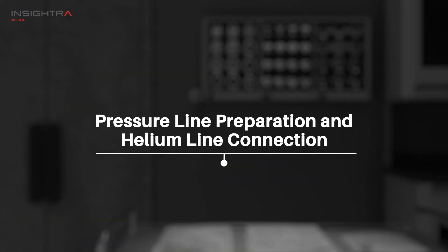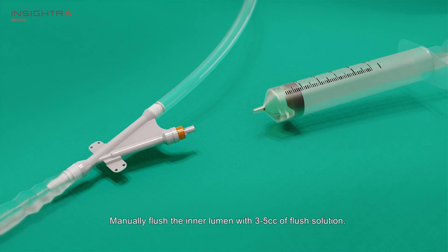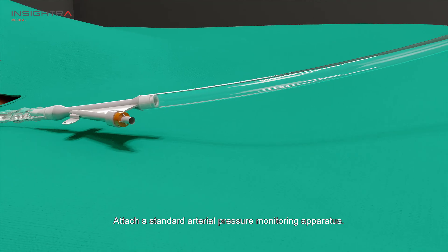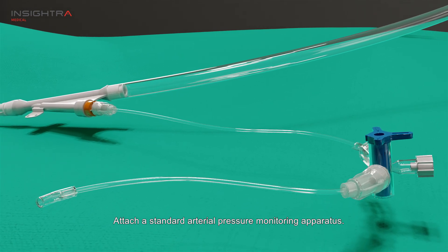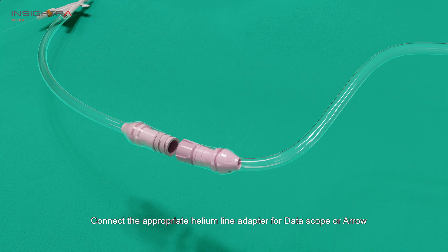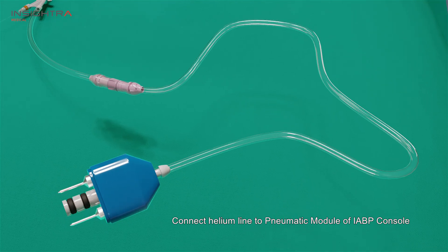Preparing the pressure line and connecting to the console. Remove the guide wire and aspirate three cc of blood from the inner lumen. Manually flush the inner lumen with three to five cc of flush solution. Attach a standard arterial pressure monitoring apparatus. Connect the appropriate helium line adapter for data scope or arrow, then connect the helium line to the pneumatic module of the IABP console.